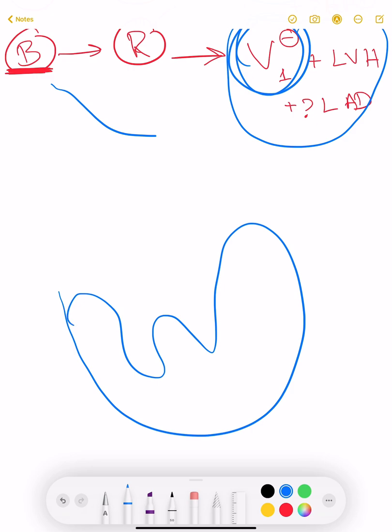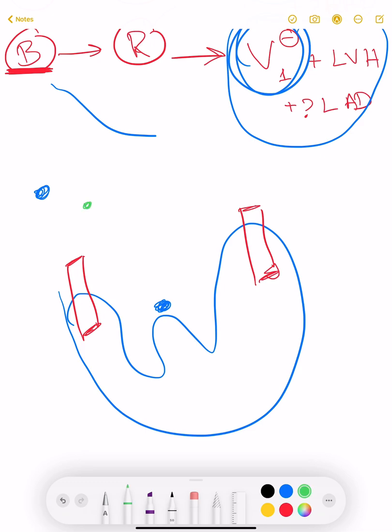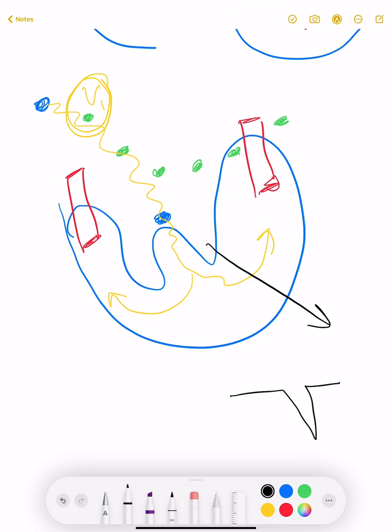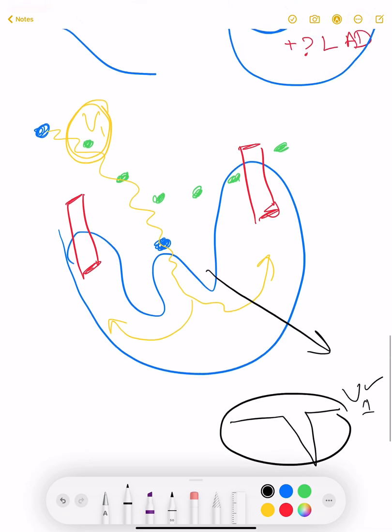Let me explain why exactly these ECG changes happen so you won't forget them. There may be two pathways, either on the right or left side. Our chest leads V1 through V6 are located across the chest. Normally the impulse passes through the AV node and depolarizes both ventricles, with most of the impulse going away from V1 — which is why in a normal ECG we most often see a negative V1.